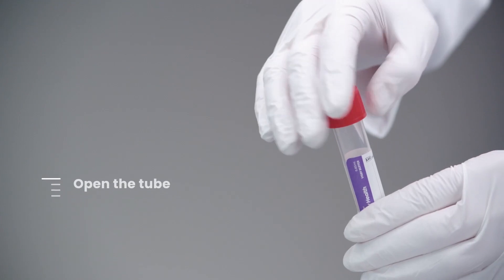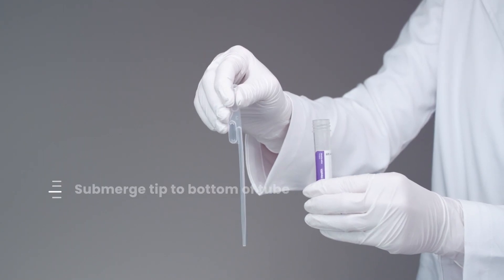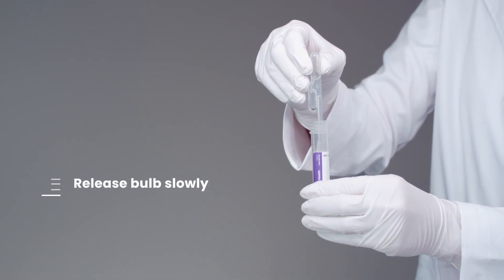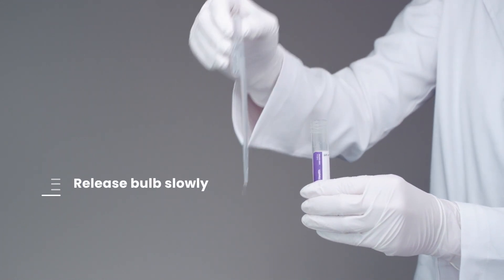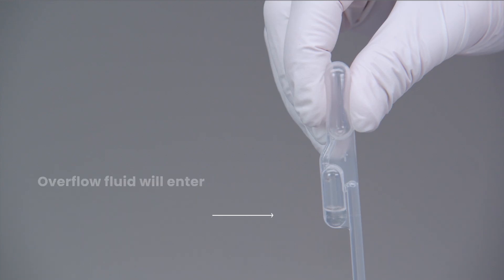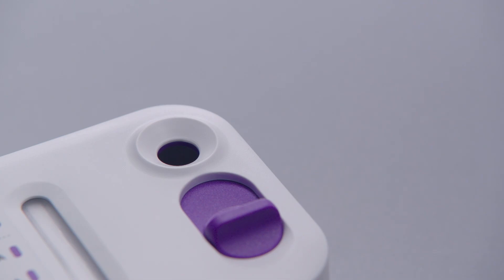Open the tube. Squeeze the upper bulb of the pipette and submerge the tip to the bottom of the tube. Release the upper bulb slowly to collect the fluid. Ensure there are no air bubbles. Overflow fluid will enter the lower bulb, indicating the pipette is fully filled.